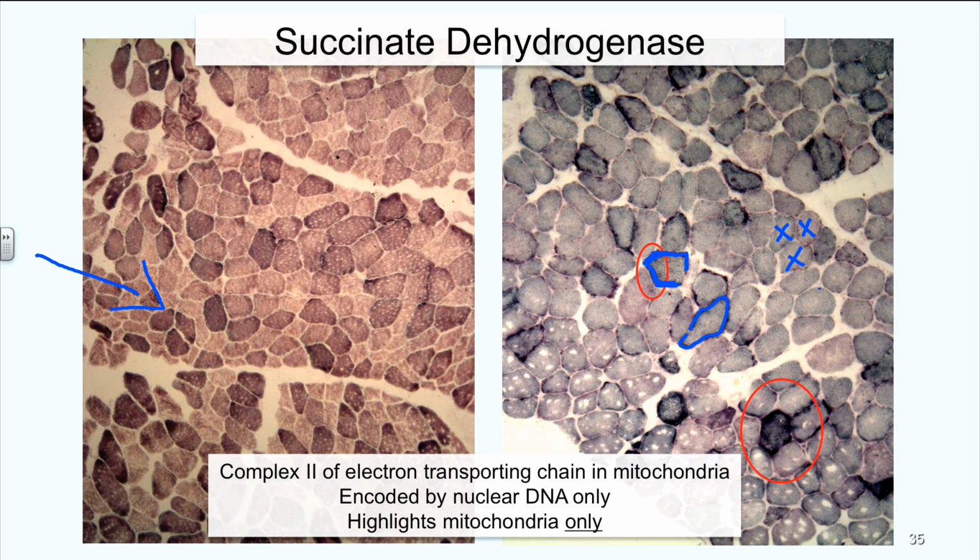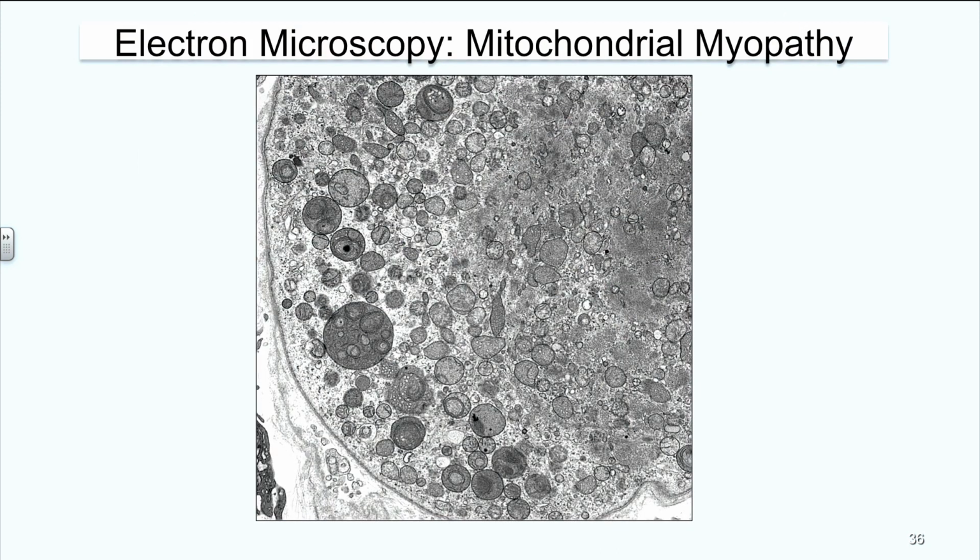Whereas a muscle fiber that has normal distribution and normal morphology of the myofiber will not have the same appearance on SDH reaction. Now for sure we know mitochondria are abnormal. That being said, there is also a big correlation with what clinicians are telling us, to say whether this is primary disease or combined with other findings on the muscle biopsy, we can say, well, this is secondary to what we're seeing. For instance, some autoimmune disorders can have mitochondrial abnormalities.